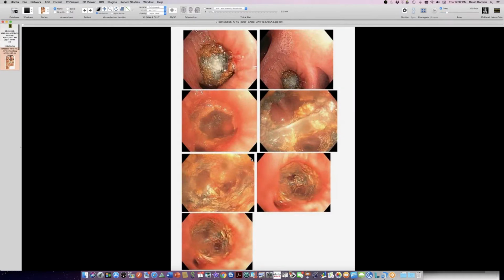And here are some bronchoscopic pictures showing you this very bright grayish thing. They noticed some discoloration in the wall of the bronchus after they chipped this thing out. They had to hack it apart to get it out, so it was not removed intact. And there was no pathologic analysis of it.